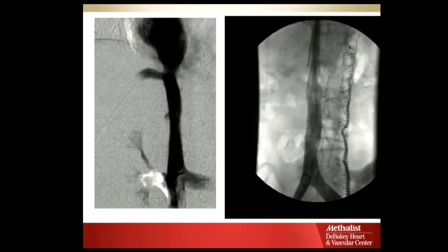And that's about it. Typically this is where you want to position the catheter if you're going to put in a vena cava filter. So 20 for 20, same as in the aorta. Dial the pressure down, 400. You get a nice picture of this. The reason this ruler is in here, this is obviously an old one, is you want to measure the diameter of the cava, to make sure that it's within the IFUs for the filter.